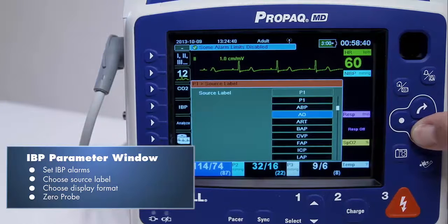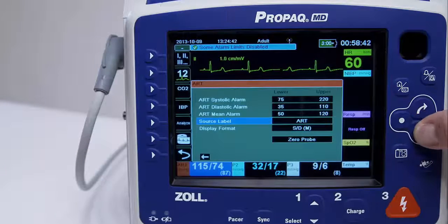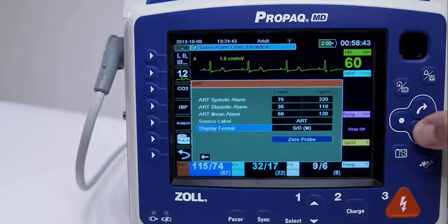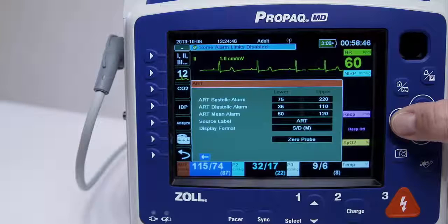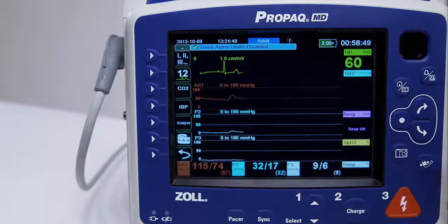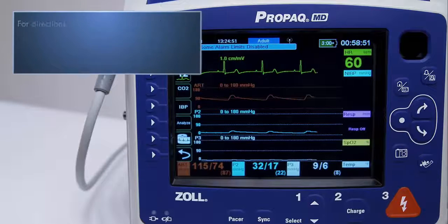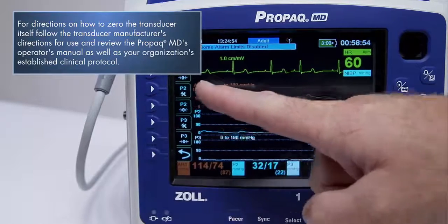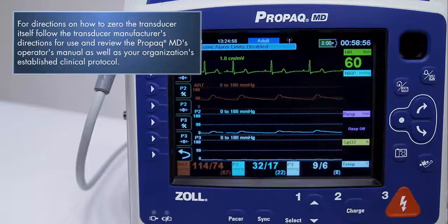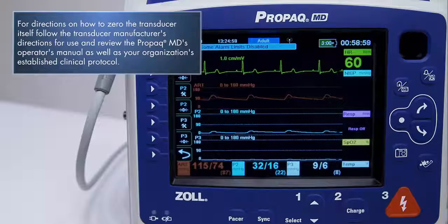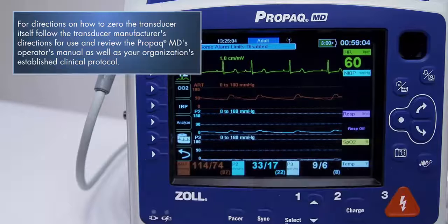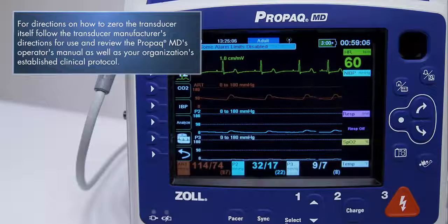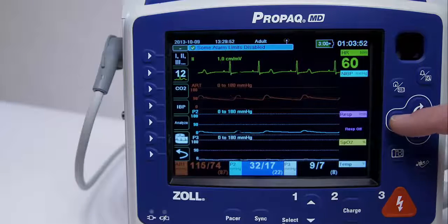To ensure that the ProPakMD unit measures pressure accurately, you must zero the transducer before each use. To zero the transducer on the screen, press the Zero Quick Access Key located on the left side of the ProPakMD. For directions on how to zero the transducer itself, follow the transducer manufacturer's directions for use and review the ProPakMD Operator's Manual, as well as your organization's established clinical protocol.